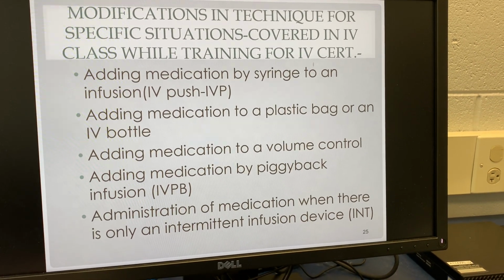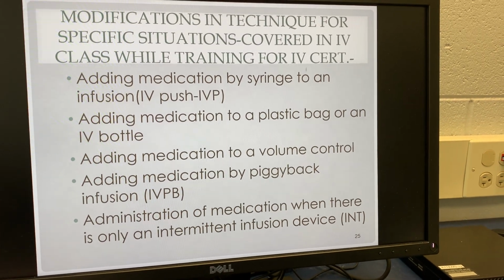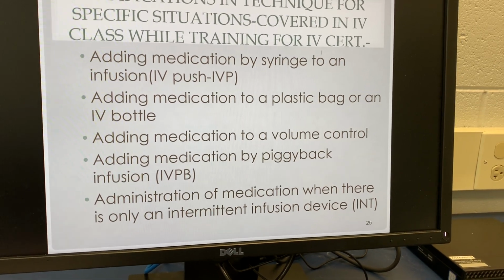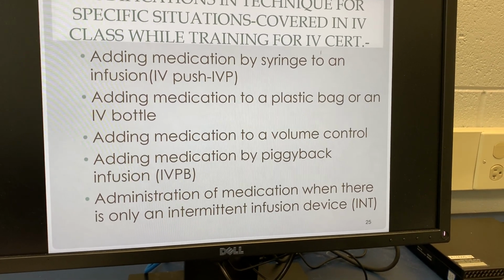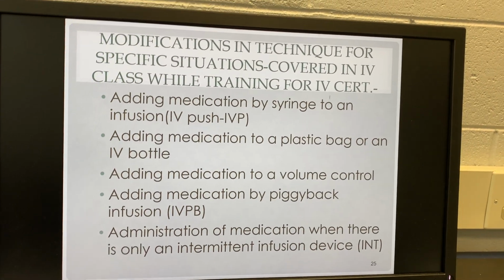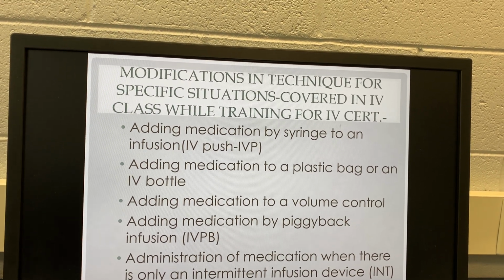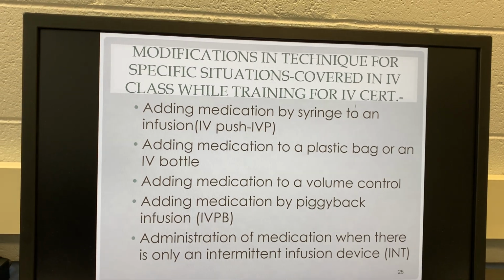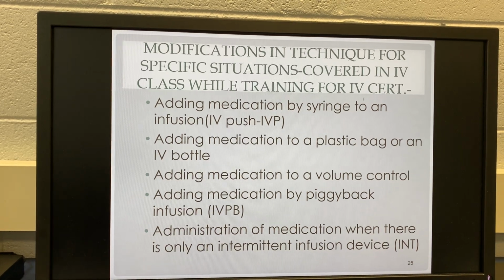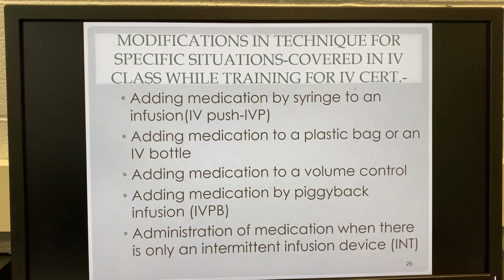Adding medication to a volume control, so a pump of some type. Adding medication by piggyback, where you are hanging a small bag and putting it in the port of a larger bag. Or administration of medication when there's just an intermittent infusion device. Many times these are nicknamed INTs, and it's a way to have IV access without having a running IV. So you'll talk about those in your IV certification class.